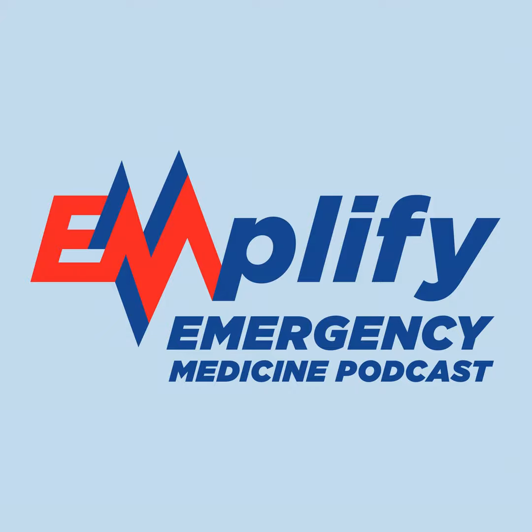And this population of patients, are they awake for this kind of mode, or are they generally sedated and potentially paralyzed? So for APRV, if you were to use it, ideally you wouldn't use it while they are paralyzed, only because one of the benefits of APRV is that they can actually breathe at those pressures. At the time in which it's held at that high pressure, they can breathe in and out just like you would with CPAP. But this is a much higher pressure than you would ever reasonably consider putting someone on CPAP at. But they can still breathe in and out at that high pressure, and that is not possible, of course, if they are paralyzed.